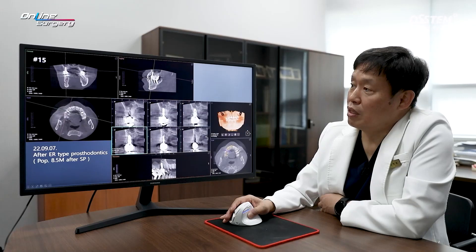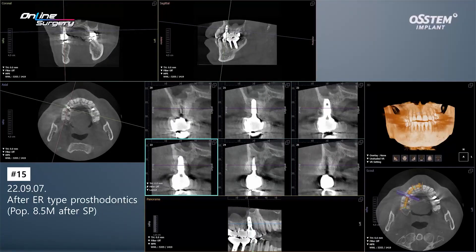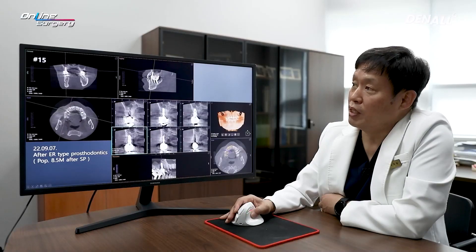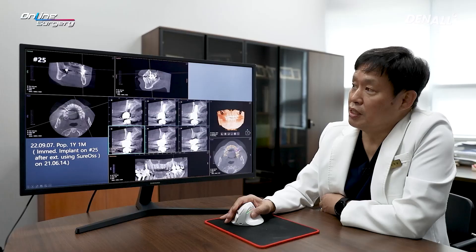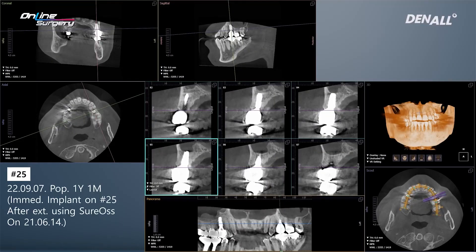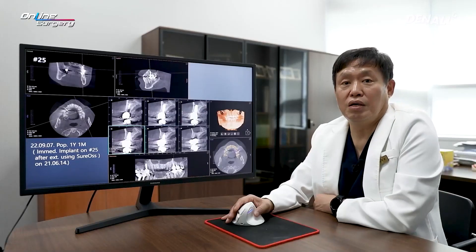Prosthesis has been delivered to number 15 — an ER type prosthesis was delivered. A-OS collagen socket preservation was done and additional bone graft was done, but you can see the bone graft material is not fully consolidated. It is well maintained. In the case of number 25, it's been about 1 year and 1 month since surgery. Immediate implant placement was done, and allogenic bone was used for bone graft in the socket gap. You can see that the buccal bone is well maintained even after 1 year and 1 month, with no major problems.